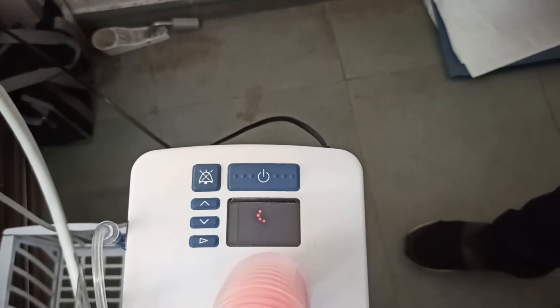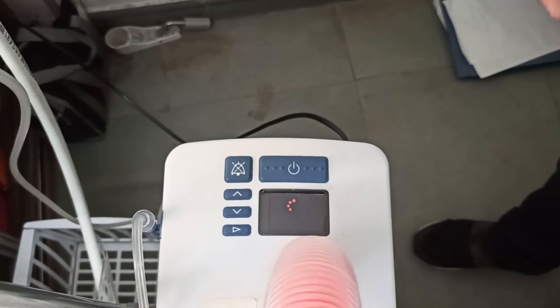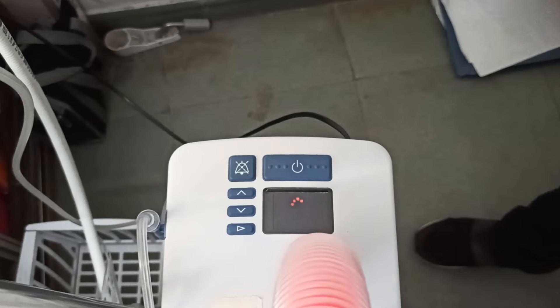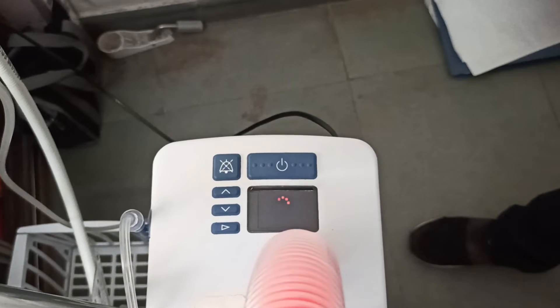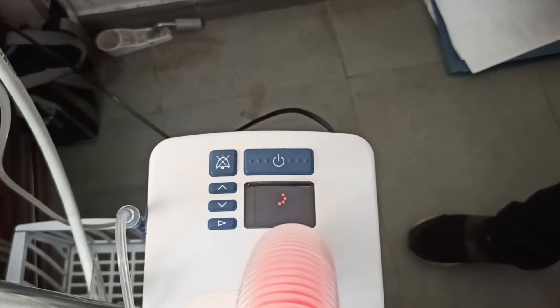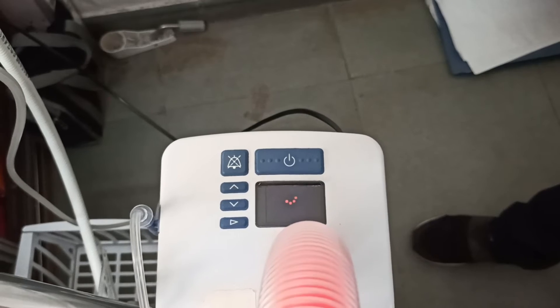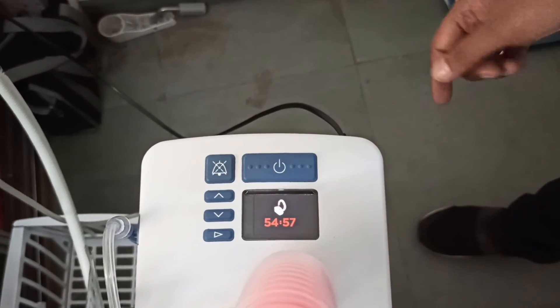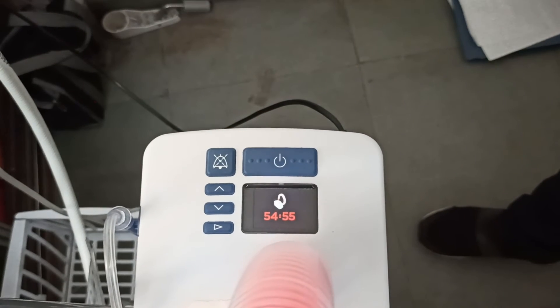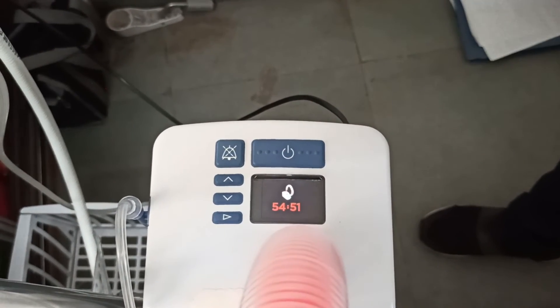The machine's temperature will start to increase continuously, and with the help of that temperature, the germs — microorganisms, bacteria, and viruses — present inside the machine will get killed. The disinfection has been started and it takes 54 minutes.